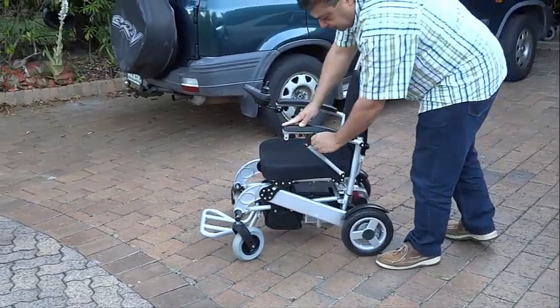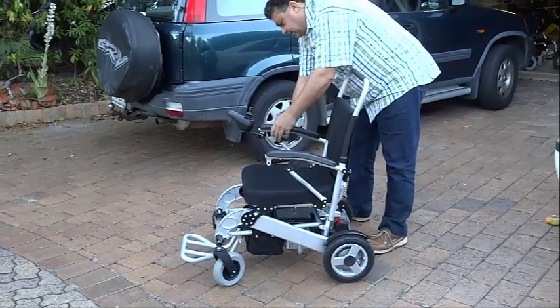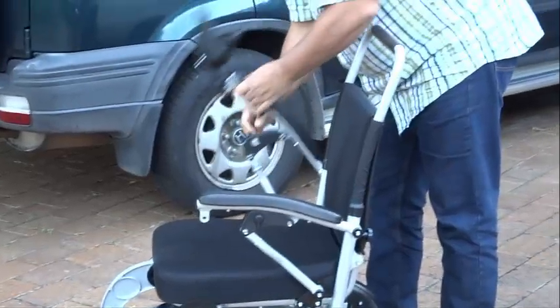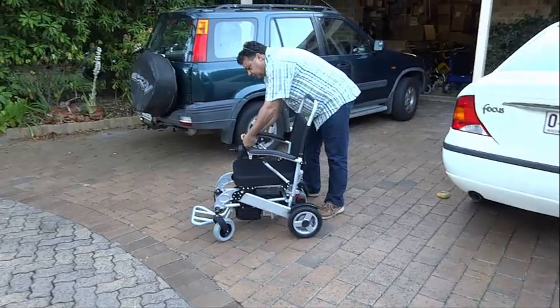Please note that the back wheels and front casters are both solid and cannot puncture. The PortaShopper 3, the Grand, and the Super Grand all have built-in suspension, but the PortaShopper Super Grand also has pneumatic rear tyres for an even smoother ride.